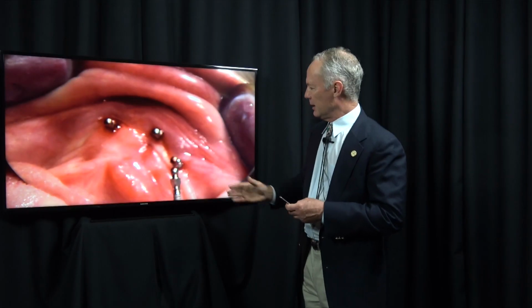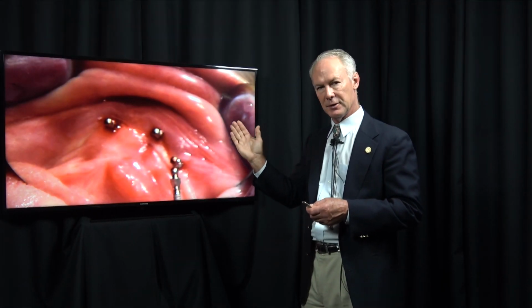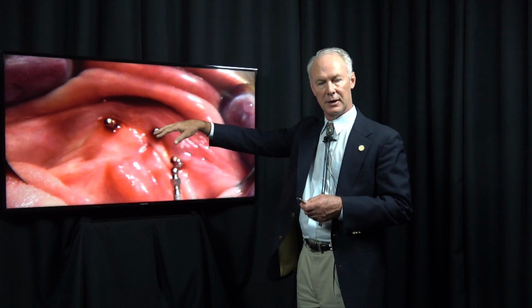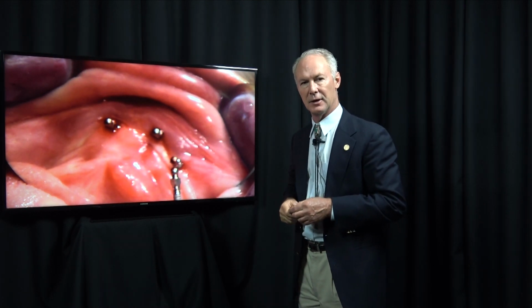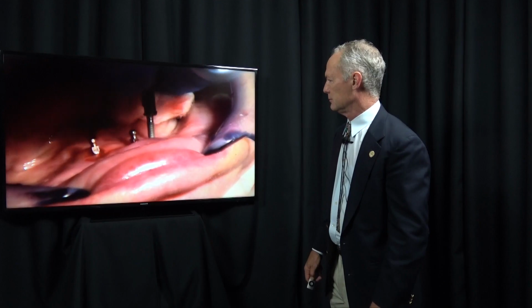Now, one of the great things about small diameter implants versus root form implants, and I place a lot of both of them, is you can have a 30-degree divergence with small diameter implants from the other implants. They can be 30 degrees off, and that's fine, and it actually enhances retention of the removable denture or partial. So you've got a little more latitude with placement.